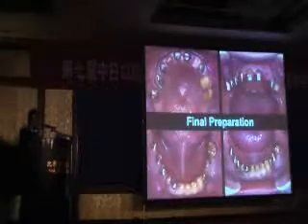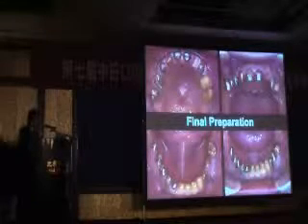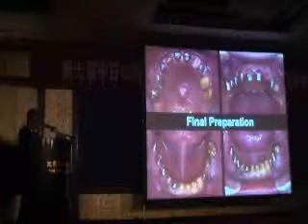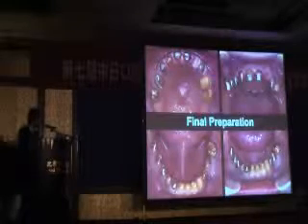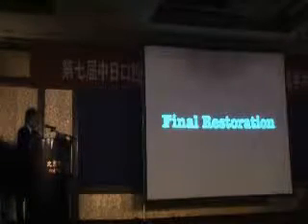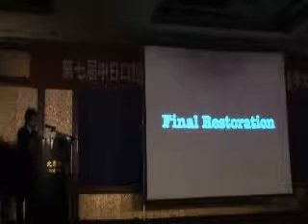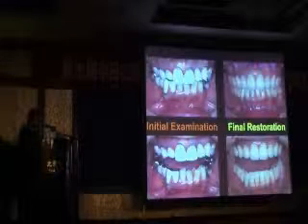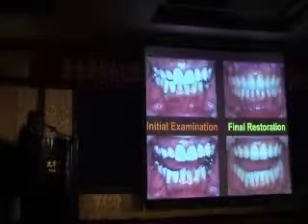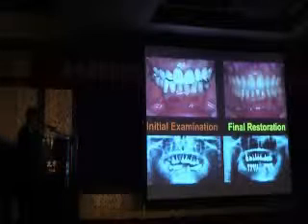This slide shows the status after the treatment and before impression. It is very important to make sure that there is no inflammation in the gingiva at this stage. After the final check with the professional, we create the final restoration. These are slides before and after the treatment. Stable occlusion, dental aesthetics, and comfort are achieved.